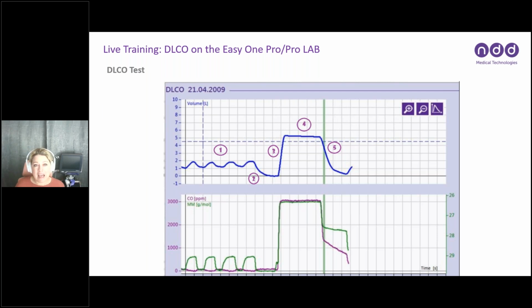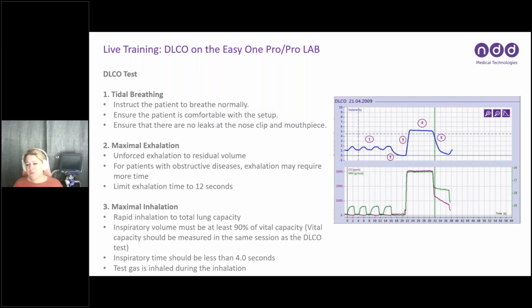That's exactly how I explain it to the patients. I always tell them there are maybe a few more steps in this test, but it's really not any more difficult. And I always let them know, not only are we going to coach them through the test, but the device also is giving us the steps one at a time as we go. So this really does give you the details of the simplified 5 steps that I just talked about.